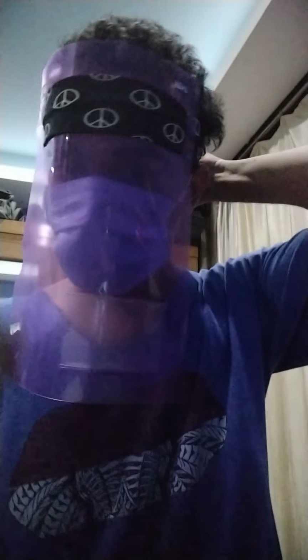This actually works, guys, and the fact that you can easily breathe, and this is also not touching your nose. Here there is like a gap of 1.5 centimeter from your nose, so it's not annoying. Also, instead of using this vertically, you can also use this horizontally, which will give you a lot more surface area like this.